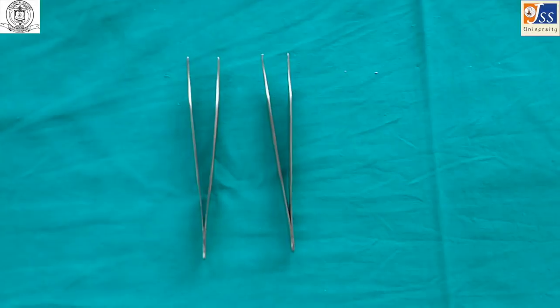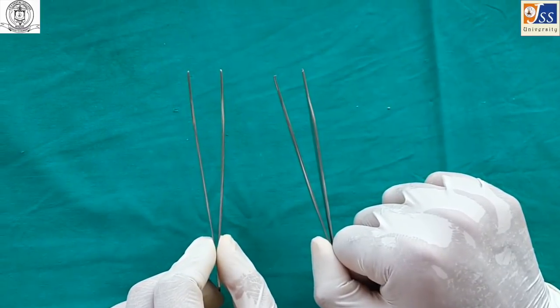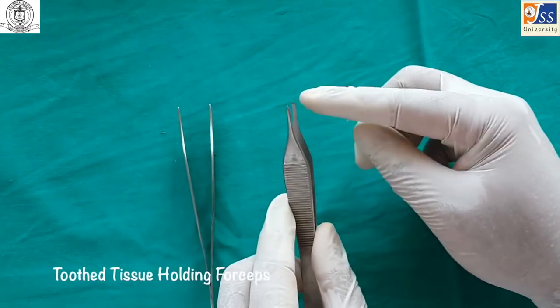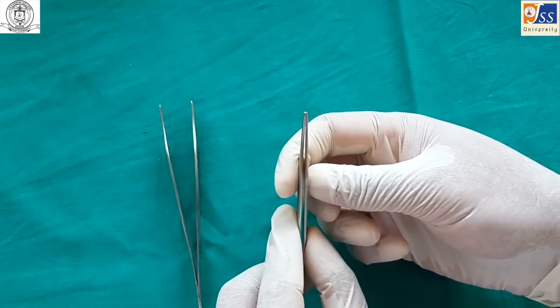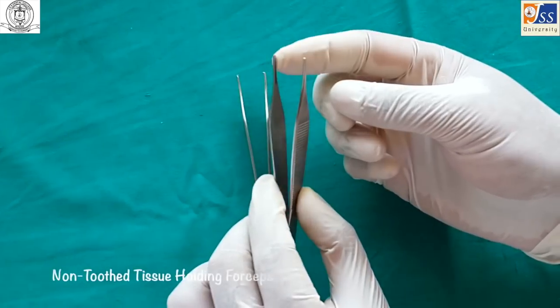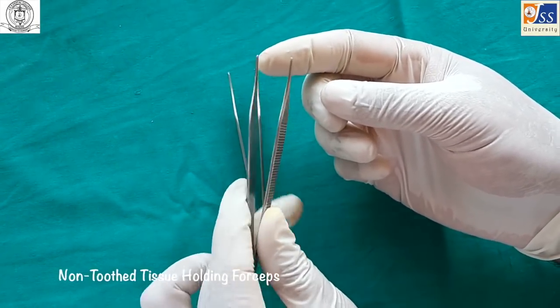Tissue holding forceps are used to grasp tissue during minor oral surgeries and suturing. They come in two variants: toothed tissue holding forceps, and non-toothed tissue holding forceps, which are used for holding delicate tissues.